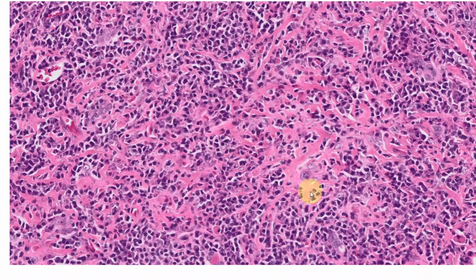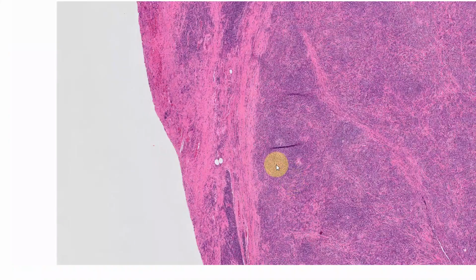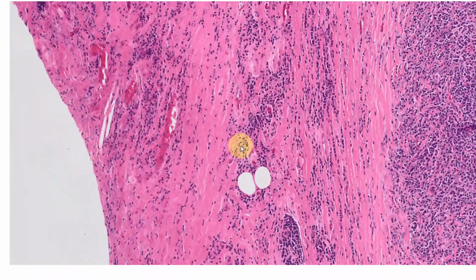And regardless of where you go, this is the morphology you'll see. This time around, here are the thyroid follicles, small atrophic microfollicles, intense fibrosis, and a bazillion plasma cells. You back out and this is what you see. Interestingly enough, unlike Riedel's thyroiditis, the fibrosis, although it extends into the capsule, does not extend into the neck and the muscles of the neck.